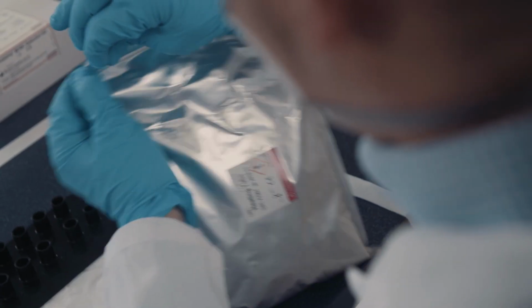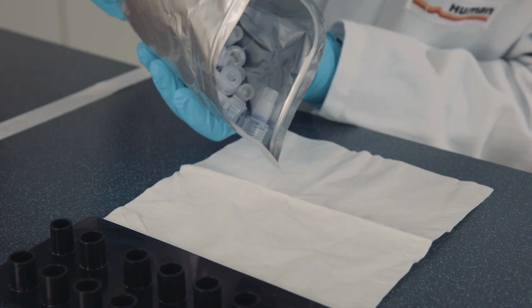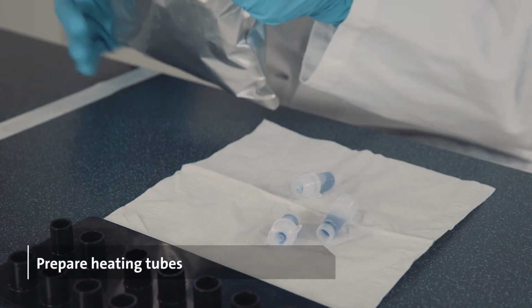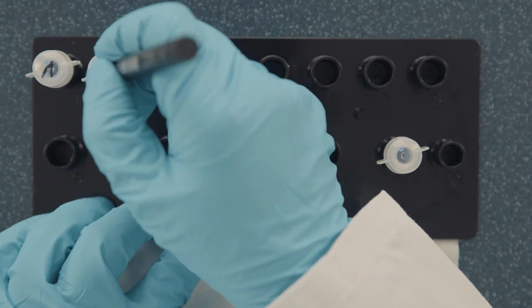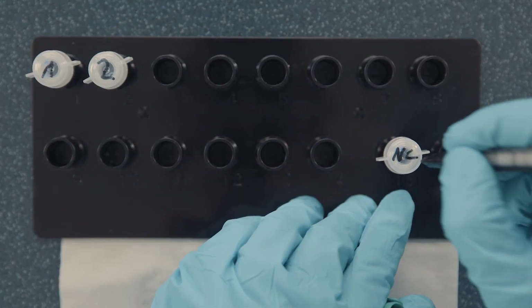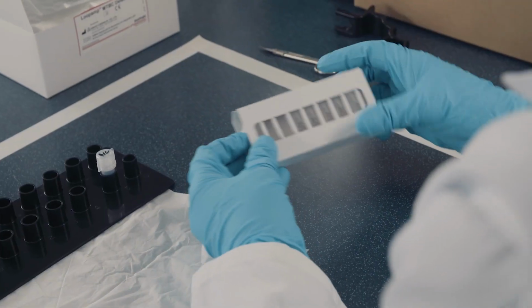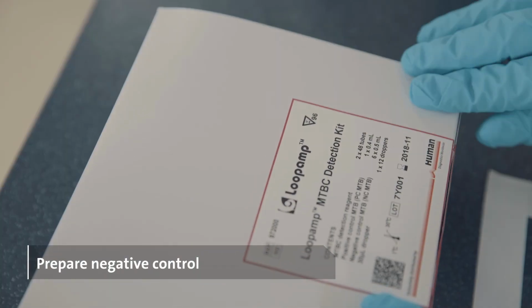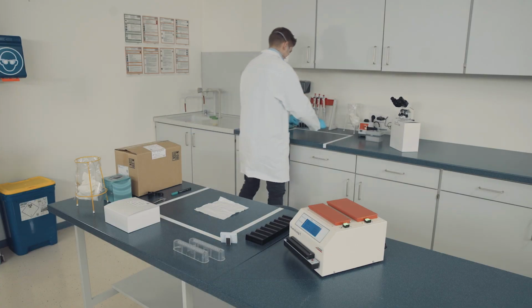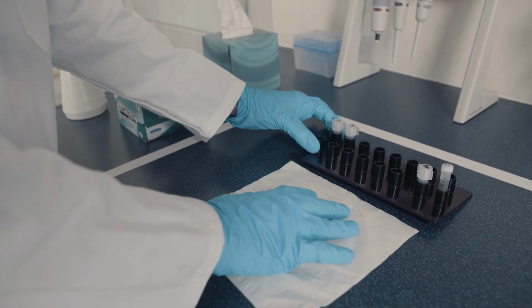Open the bag and pour out the appropriate number of tubes, plus 1 for a negative control. Do not reach into the bag to avoid contamination. Subsequently, mark the heating tubes. Open the Loopamp MTBC detection kit and take out the negative control. Now prepare the second working area with the soft cloth and the rack with the tubes.